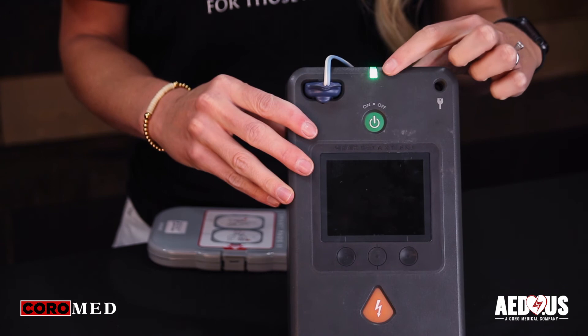Once you change the pads and batteries, verify the ready indicator is flashing green and the AED is ready for rescue.